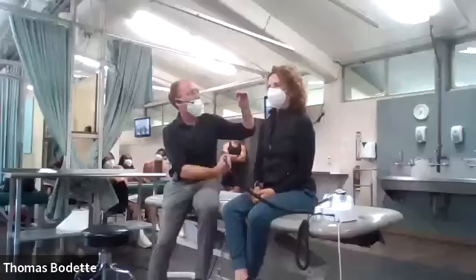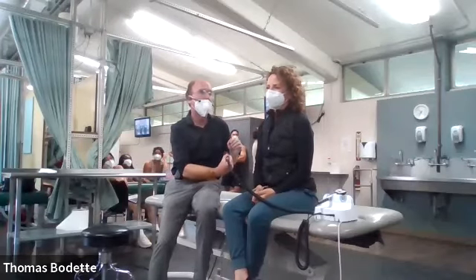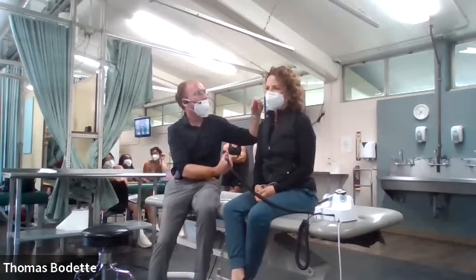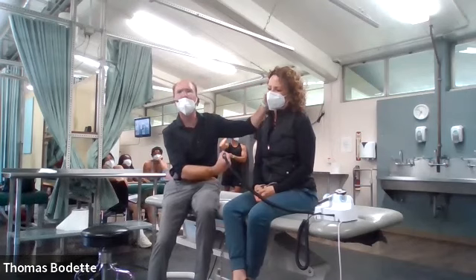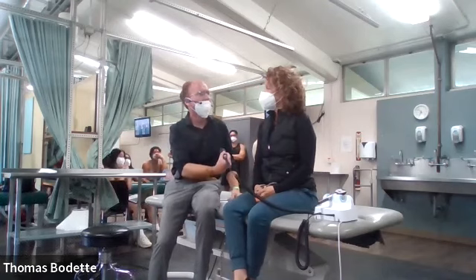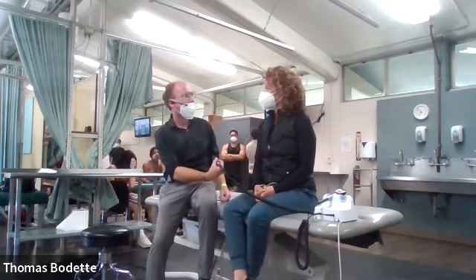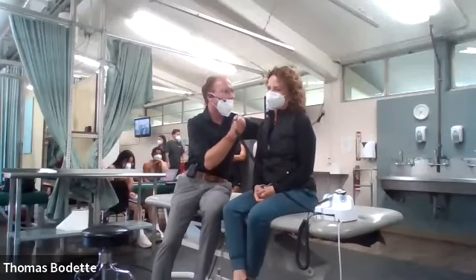All right, so anatomically, how do I position the ear? I need to pull the pinna of the ear up and back if it's a younger to middle-aged person. If it's a child, it's a little different. I think it's just straight back. That sound right? I don't like kids. Anyway, so up and back for adults.